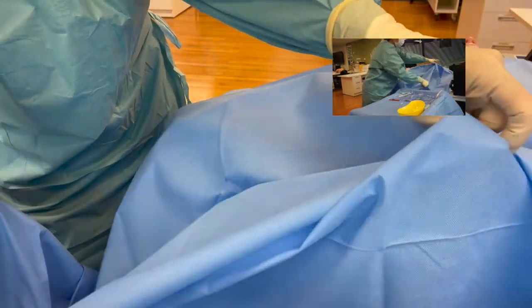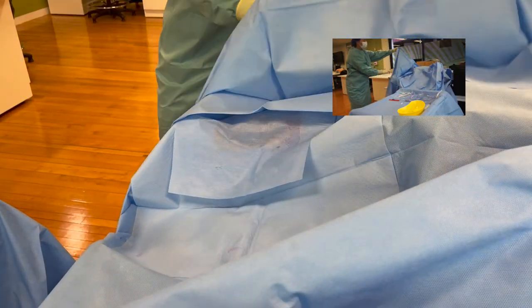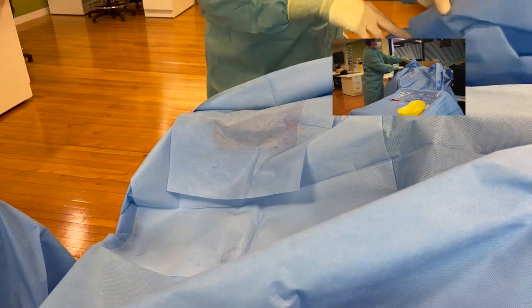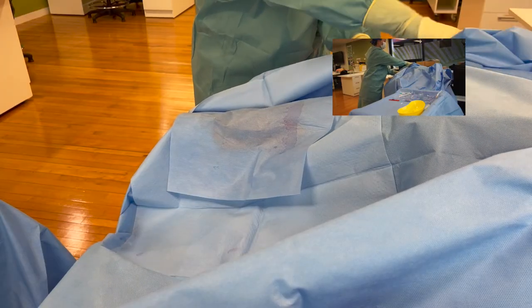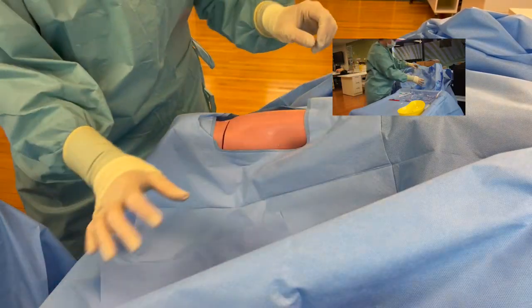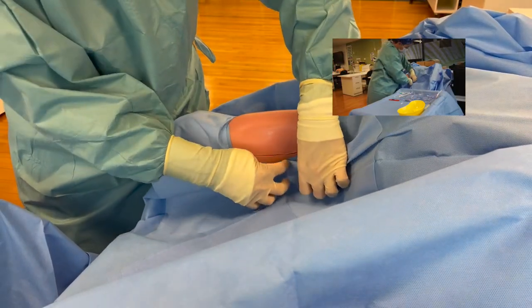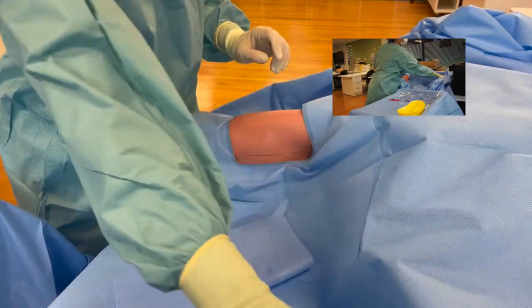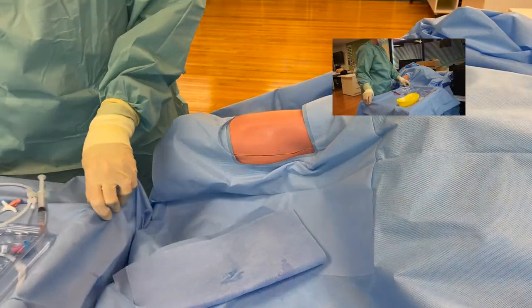This drape has been refolded in an incorrect fashion - you would usually do the feet second. Cover up the head. Your assistant, or you if you've got a sterile area, can make a little tent for the patient, but be careful not to desterilize yourself - that might be easiest if you have your assistant doing it. This is just a protective covering. Make sure your drape is adhered to your patient in an appropriate location for your vascular access. Pull down the foot part second.